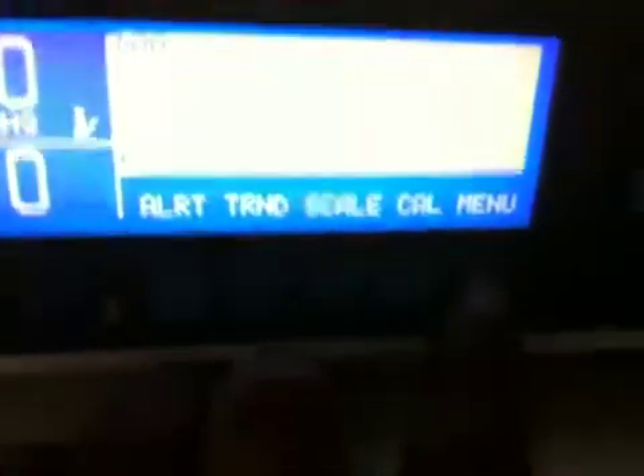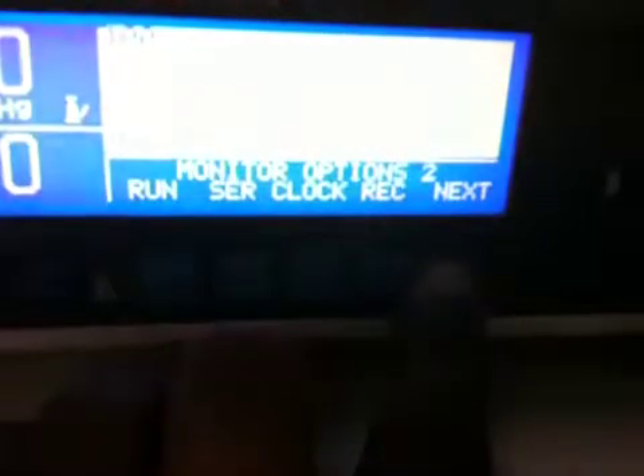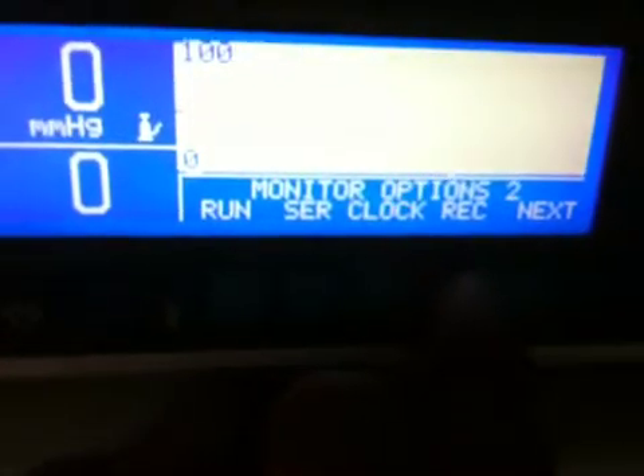Then, to calibrate the KAPNA guard to the computer, you just press and hold Menu. Press Next, Next, until you see REC.